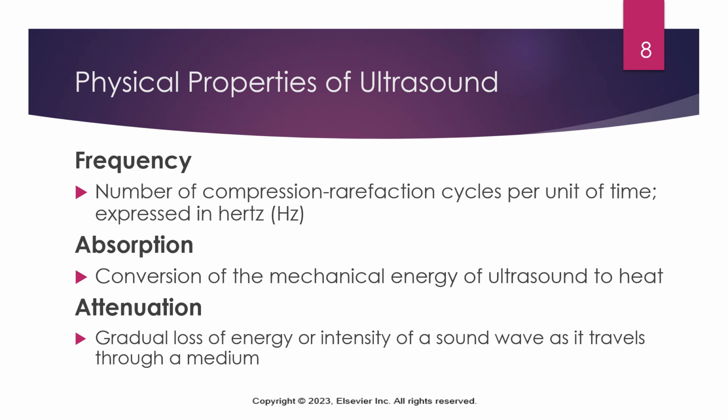And we've talked already, when we first discussed specific heat in our lecture introducing thermal agents, that bone is also something that you have to consider and be aware of because it has low specific heat, just meaning that it heats up very quickly. It doesn't need much energy to heat up. So we'll talk about the risks associated with ultrasound a little bit later when we start looking at the precautions and the contraindications. But absorption is how we convert that mechanical energy into heat in the body.